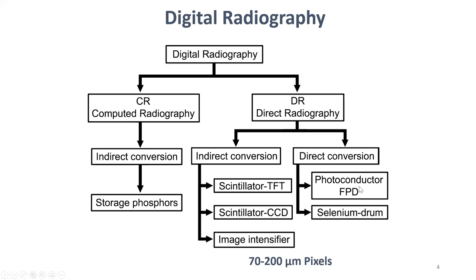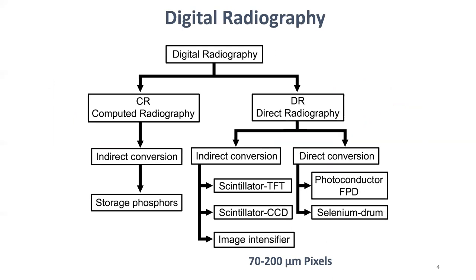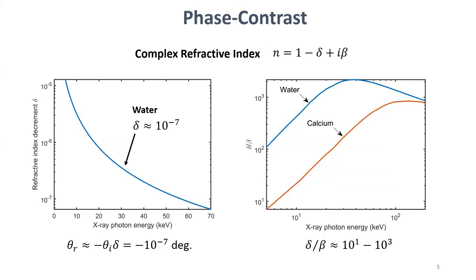So it should be pointed out, for most of these existing solutions, the pixel size is typically in the 70 to 200 micron range. They're not usually a lot smaller for a variety of reasons. For scintillators, you typically have spread in the scintillator that doesn't make it worthwhile to shrink the pixel, because if you shrink the pixel, then you're forced to shrink the thickness of the scintillator. So you lose quantum efficiency. And in the direct conversion materials, there hasn't been a direct conversion material amenable to going to small pixel, other than evaporated materials like selenium. For all the other ones, you need some kind of bump bonding process that ends up making the pixel larger.